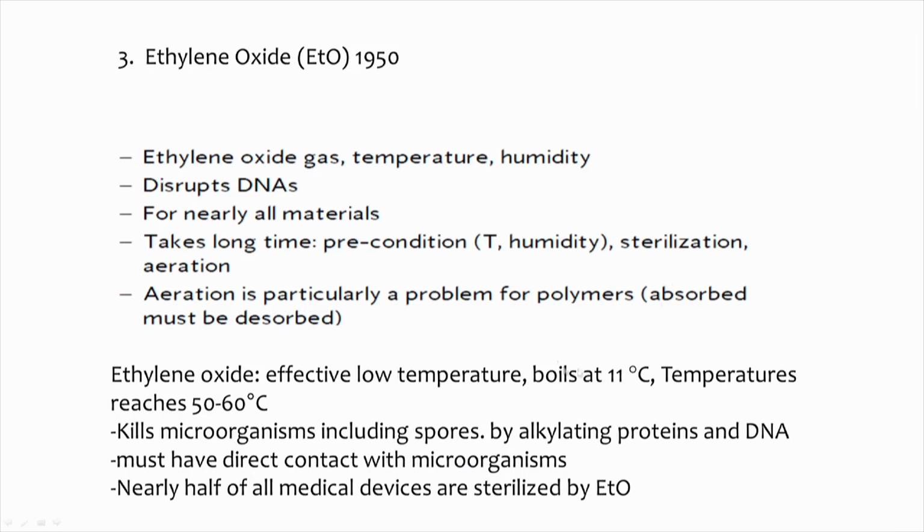Ethylene oxide, generally at 50 to 60 degrees centigrade, kills microorganisms including spores by alkylating proteins and DNA. So, it should have direct contact with the microorganism, because ethylene oxide will directly get in contact with the microorganism and do the job, unlike the normal autoclaving approach.